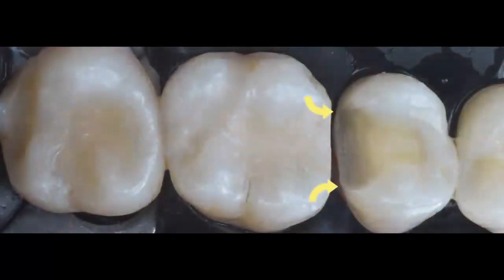Once we removed the old restorations, I decided to do this case one at a time, instead of doing it back to back. The reason is that I knew the distal box of tooth number 13 was going to be a wide box. What you're seeing here is not only a deep box, approximately 4 to 5 millimeters from the marginal ridge of the neighboring tooth, but also a wide box, 5 to 5.5 millimeters wide from buccal to lingual.